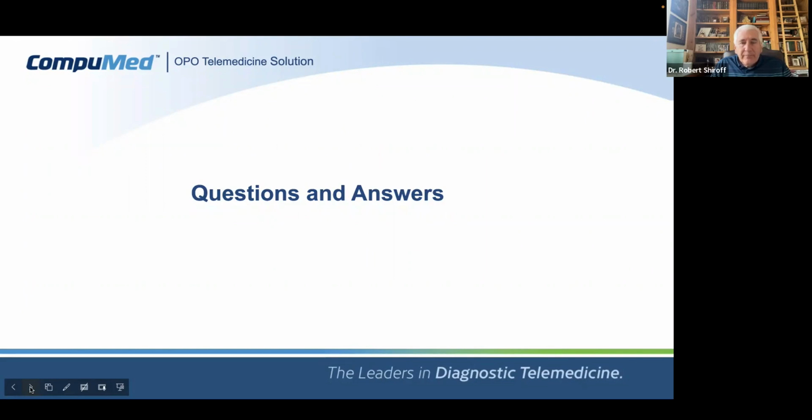Stacy also asked, how much does technique of echo determine LVH? I've seen reports of LVH by hospital reads, and when we repeat the echo, LVPWD is only 0.8 and the heart is transplantable. This is the scenario where the hospital staff performed both echoes. I think these things can change. Besides the fact that technicians can make it, you can get a bad angle. And if your angulation is not good, and the position is not classic view, you can get an angulation that makes it look bigger, that makes it look thicker.